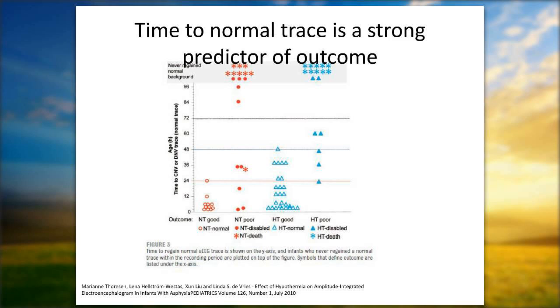I think there's just so much to learn by putting on these couple of electrodes. Of course, there are limitations. We all acknowledge some of those limitations, but certainly in the case of babies with HIE, there's a lot of benefit to being able to see what's happening inside when their clinical presentation is still so obscured by their disease and by medication. Having the aEEG there can really reassure us whether what we see is matching what's happening in the brain and help us to direct care.